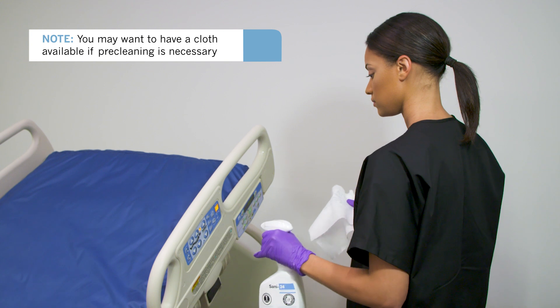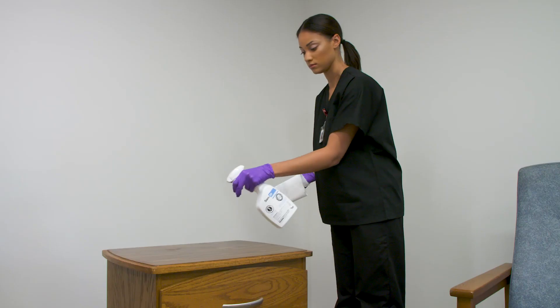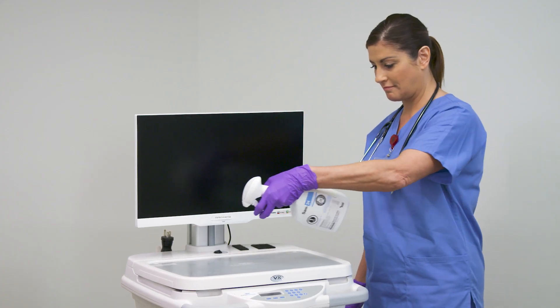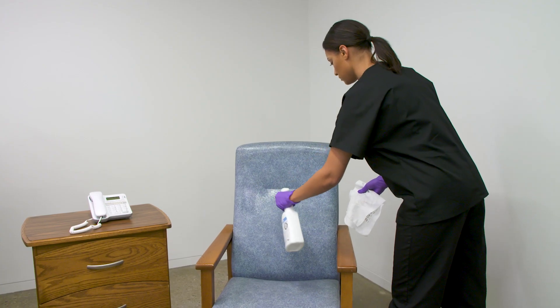Use Sani24 Germicidal Spray on high-touch surfaces such as bed railings, bedside table and handles, overbed tables, workstation on wheels, telephone, as well as chairs.